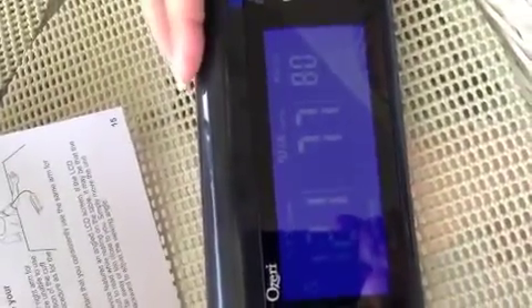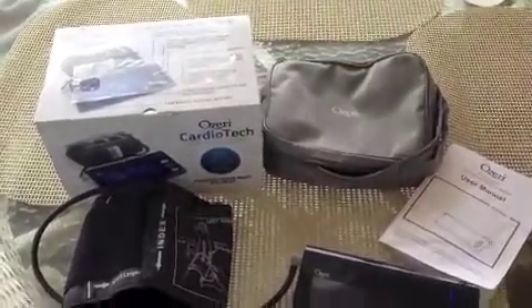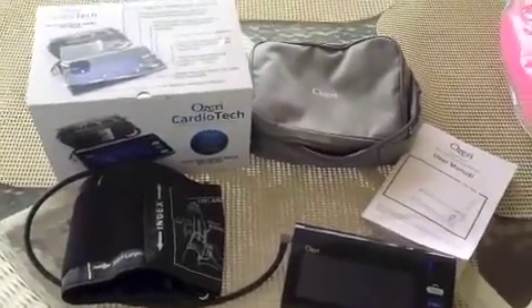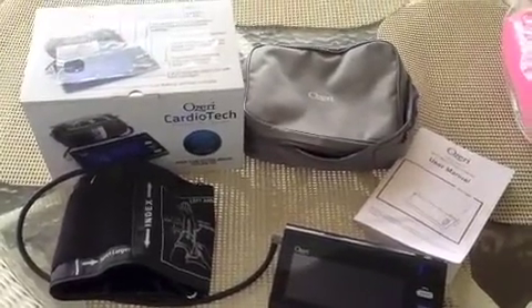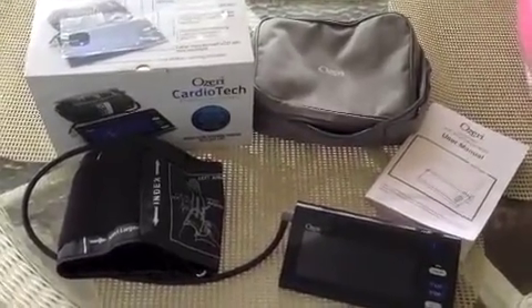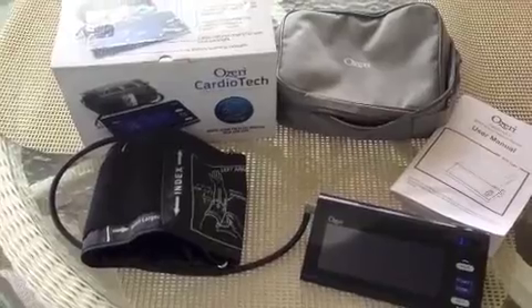That's it — Ozeri Cardio Premium Series Digital Blood Pressure Monitor with Arm Cuff. It's great, it comes with a bag. We'll be traveling 5,000 miles this summer and I'll be able to take it in the car and use it. It runs on batteries so you don't need to plug it in. You could take it camping or wherever you need it and you don't have a plug. I highly recommend one of these — I don't know why it took me so long to get one. Thank you Ozeri for the Digital Blood Pressure Monitor.